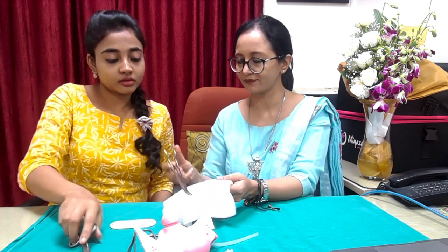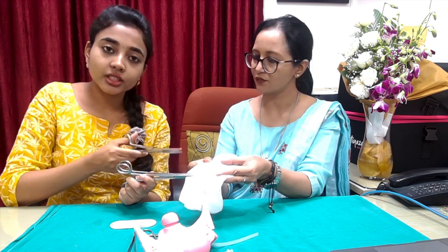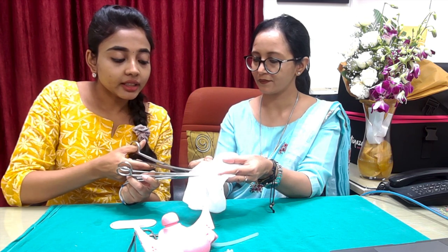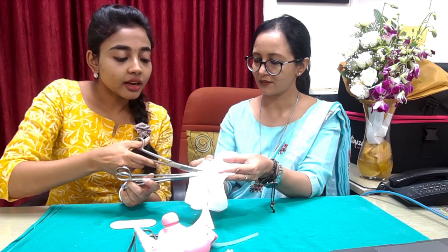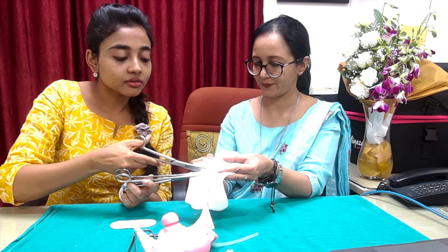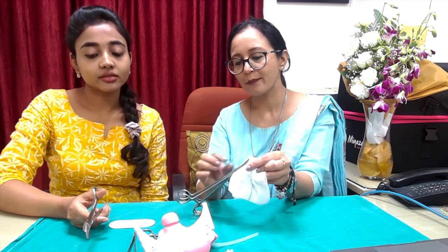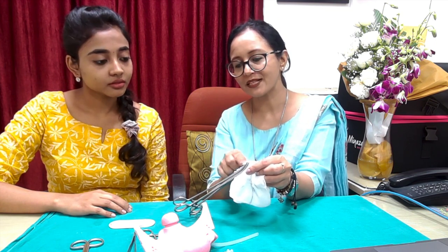Once clamped, you hold the pedicle and begin cutting. Do not cut very close to the clamp — leave a little tissue so you can transfix or ligate that portion. Begin cutting a few millimeters before the base of your clamp, and do not cut straight across. Cut little by little in a criss-cross pattern until you reach the tip of the clamp.